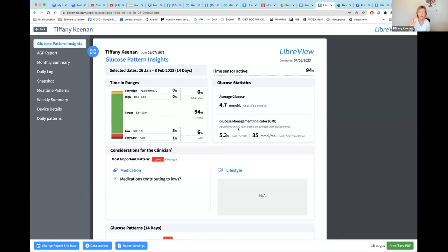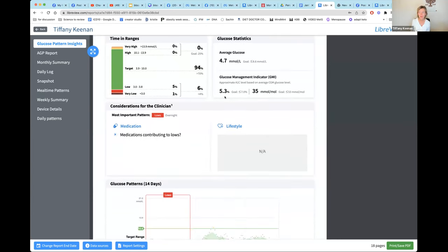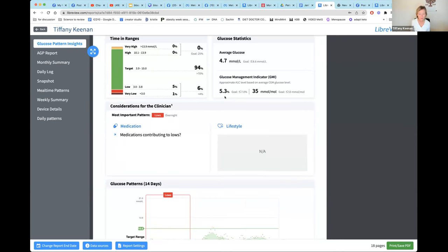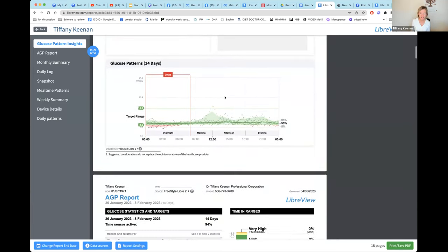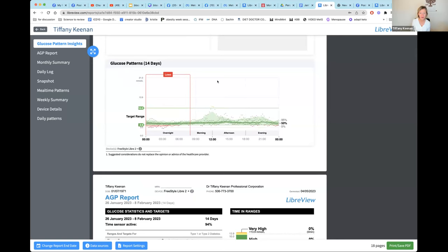There's a Glucose Management Indicator, which gives you an approximate A1C — your three-month average blood sugar. Then the next section is a lot of fun: every time you scan, there's a dot, and all those dots come up in a diagram. For me it noted I had some lows overnight — that's the computer trying to give you a little analysis.